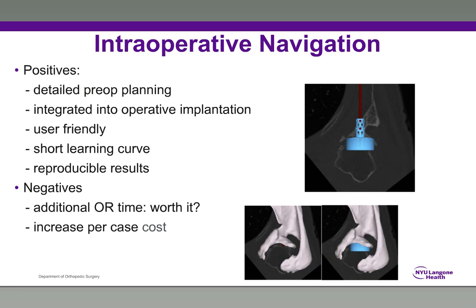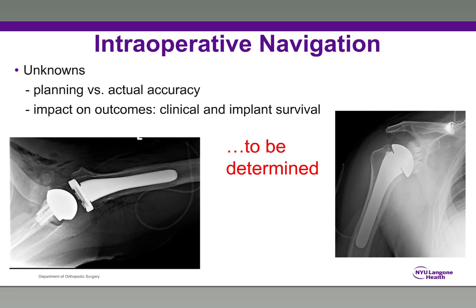There are negatives. It does take more OR time, although it decreases with experience. And there is an increased cost per case, which ultimately has to be considered for the institutions where you work. And the longer-term question is, is it going to be worth it? Can we provide the results that are needed? Those are the unknowns.